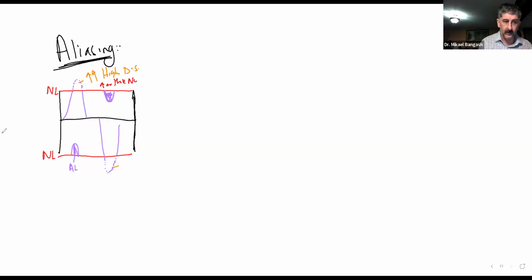Let's say that was, for instance, 100. So if you had a velocity of 150, that remaining 50 was going to become aliasing. Did you guys get that?